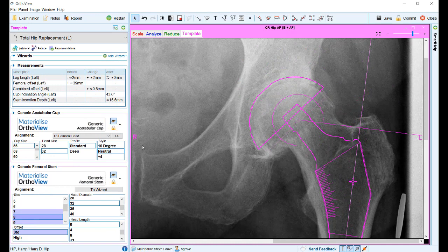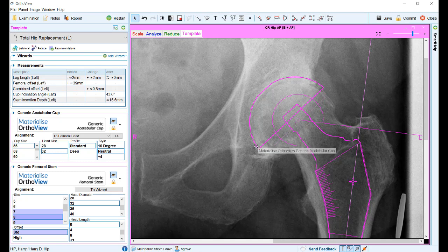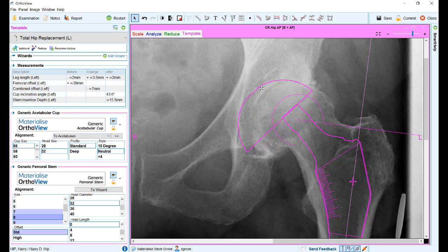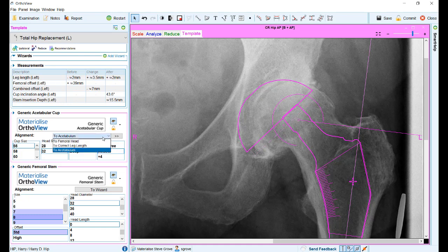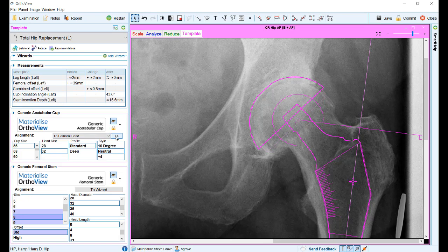With the addition of the cup positioning wizard, there are now alternative options for positioning the acetabular cup. The two new alignment options are: to femoral head — the traditional reference point used by OrthoView, located on the circle marked in the smart hip or hip AP joint wizards — and to acetabulum, which centers the cup on the circle marked with the cup positioning wizard. The user can freely swap between the two options, but the positioning will only change if the appropriate wizard is being used. If the user manually repositions the cup, the double arrow box allows resetting back to the default position.